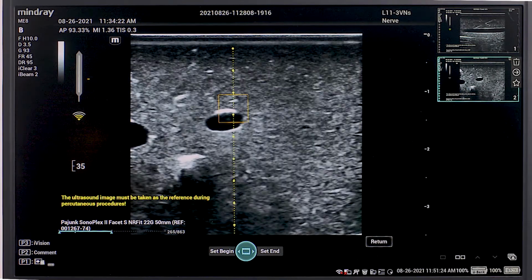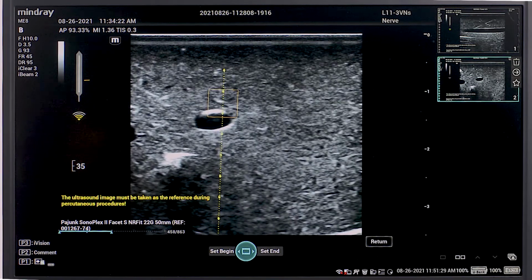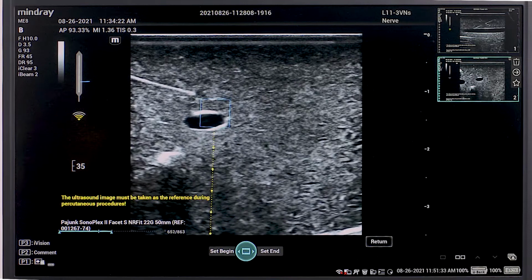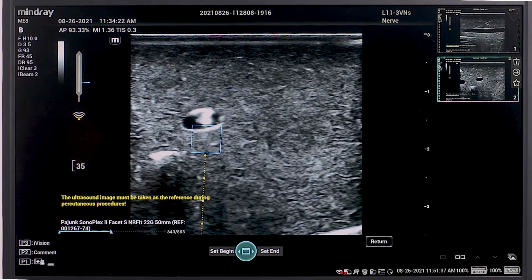For out-of-plane procedures, change the angle and degree of the needle to change the target box location. Advance the needle towards the target. The top yellow dot is the needle tip. Blue indicates the needle is crossing the ultrasound beam, light blue is close to the beam, and orange means the needle has fallen out of the ultrasound beam.